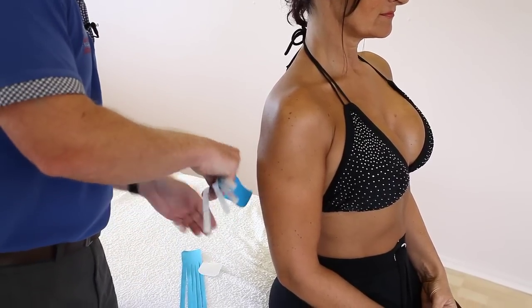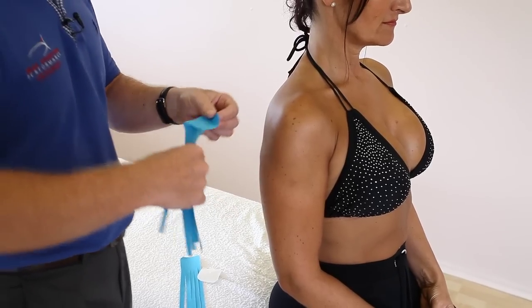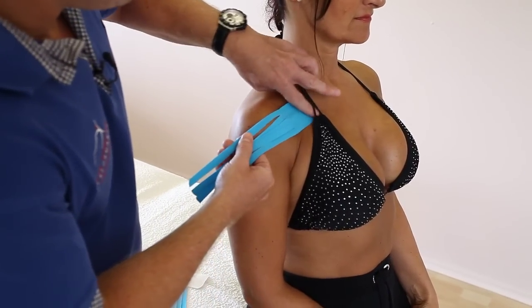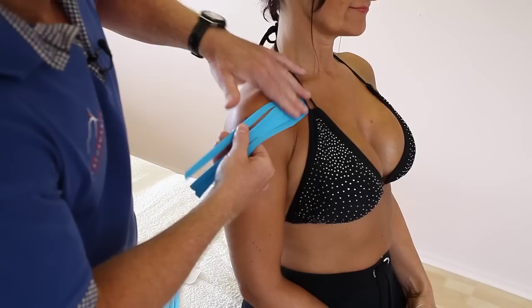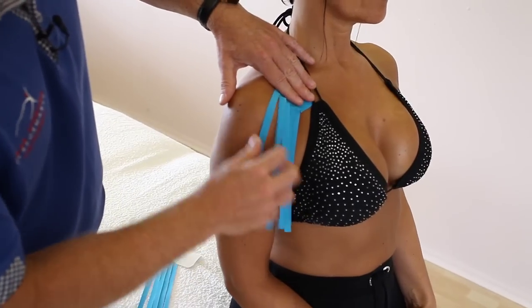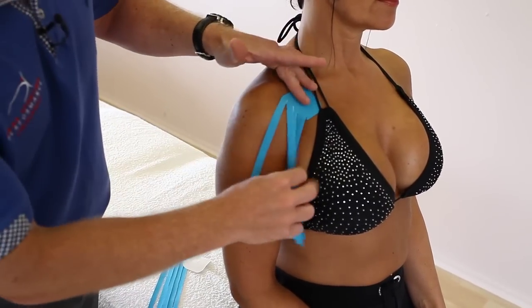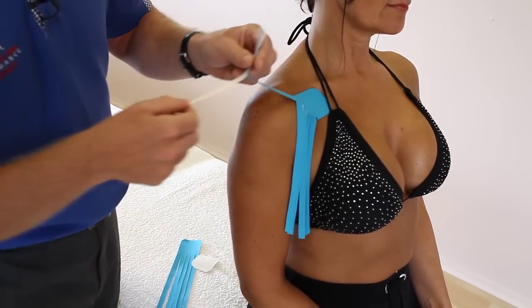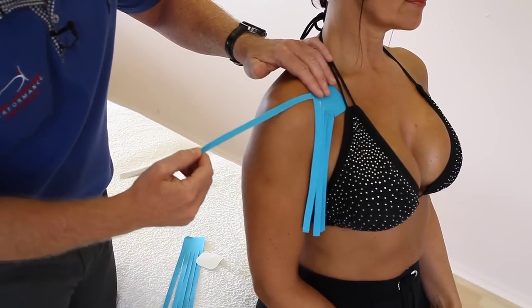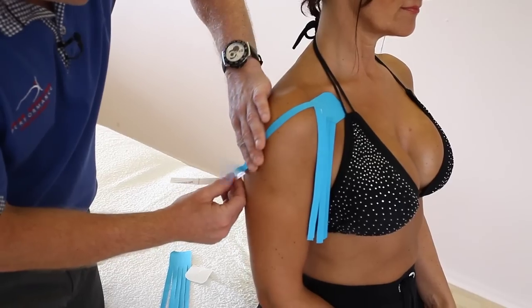The first application of the pad is going to be around the coracoid process, like so, or just medial to the coracoid, going this way. So what we're going to do with these five fingers is literally feed them out with no stretch, just a little movement of the tape coming down like so.